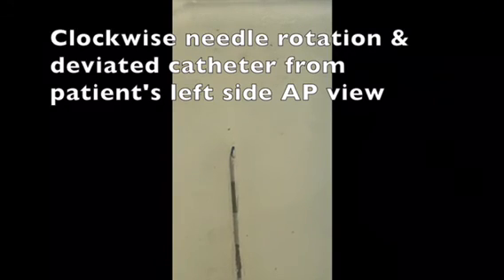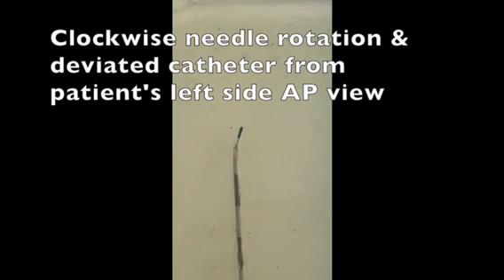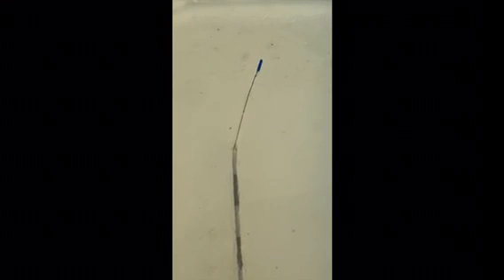Where is the pressure? If the patient says, I still feel more pressure on the left side, but more toward the midline, I will rotate the needle more toward the right side and re-advance the catheter until the patient reports, I feel the pressure in the middle of the back. And I re-advance the catheter 4 centimeters more until it stays in the middle of the epidural space.